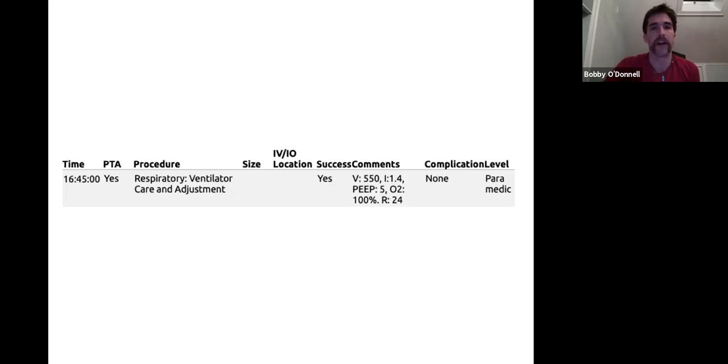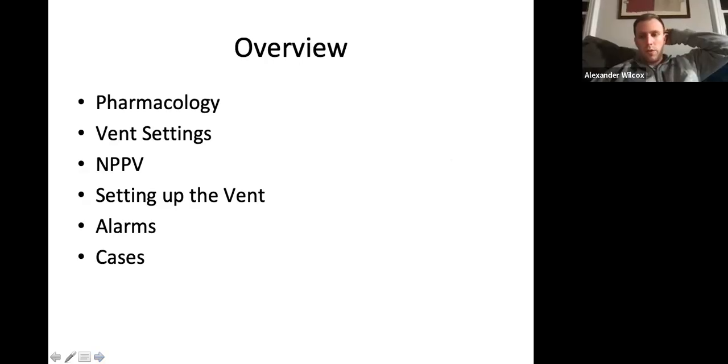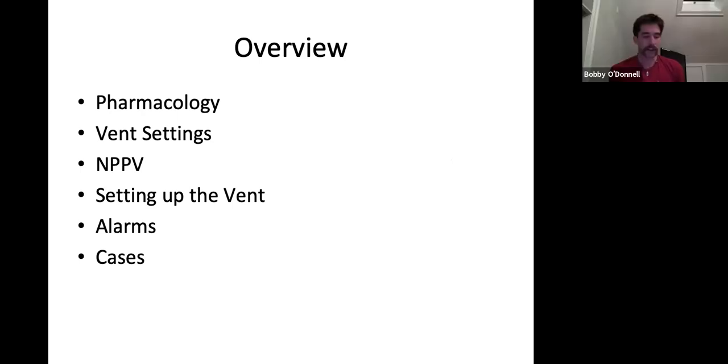So, all right. There's a new and old vent sheet that I've seen that's still floating around. The old one streamline is missing a couple of values, but there's a new one that I think Evelyn or somebody sent out a year or two ago. Yeah, that's nice. We'll talk maybe a little bit at the end, especially in regards to proper vent settings and rates and stuff.